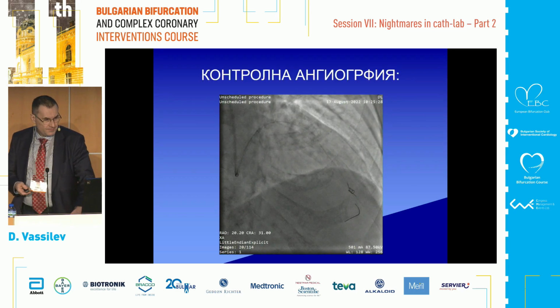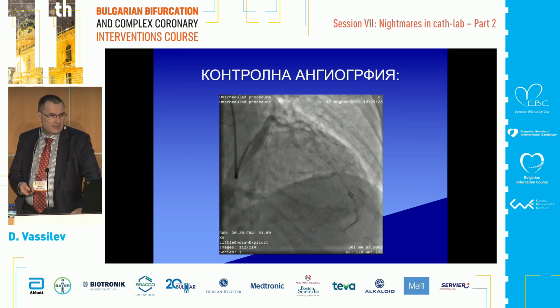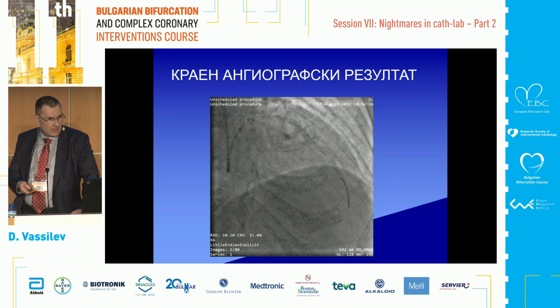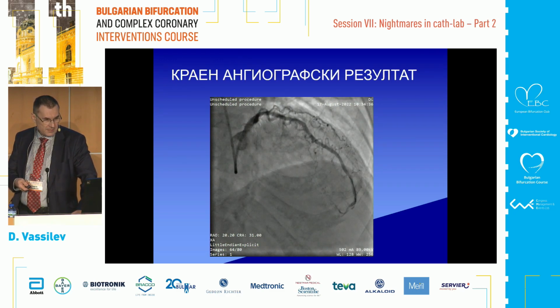This is the angio after ballooning into the true lumen. Then we removed the wire from the subintimal space, and this is the final result for this case.